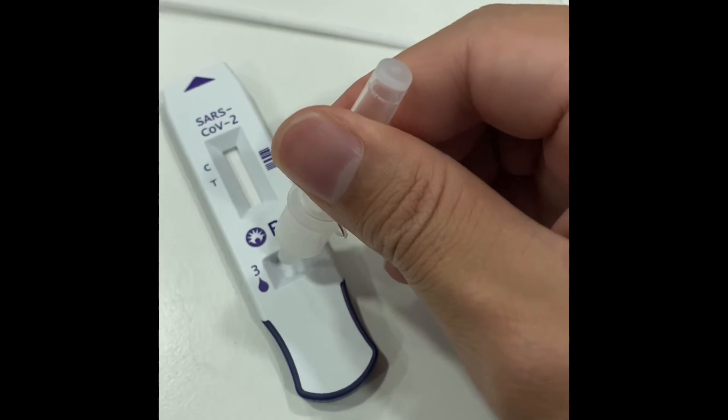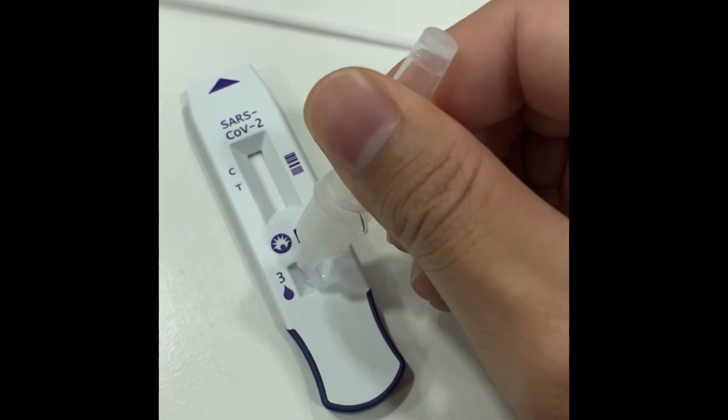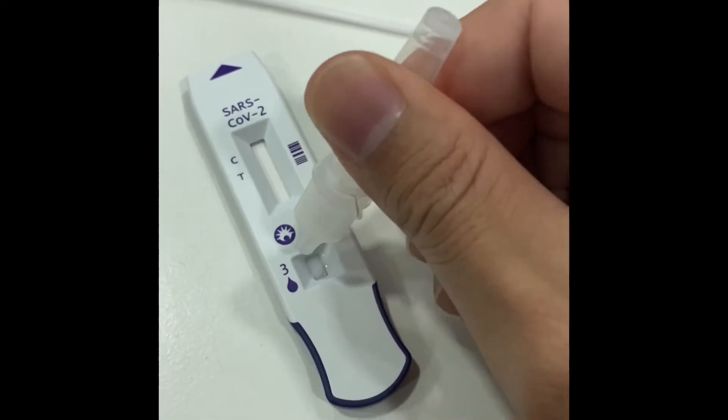After that, place three to five drops approximately onto the sample well of the test cartridge.